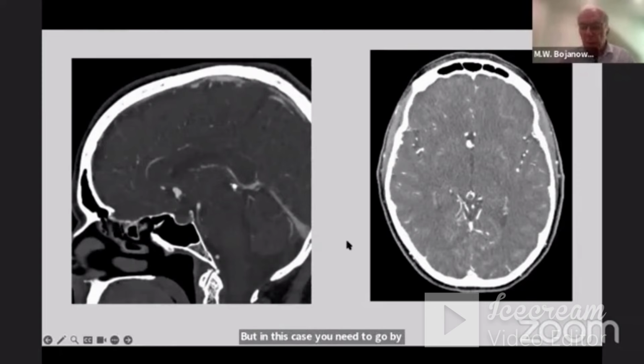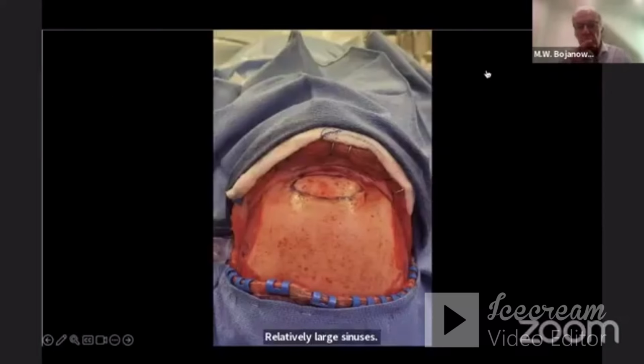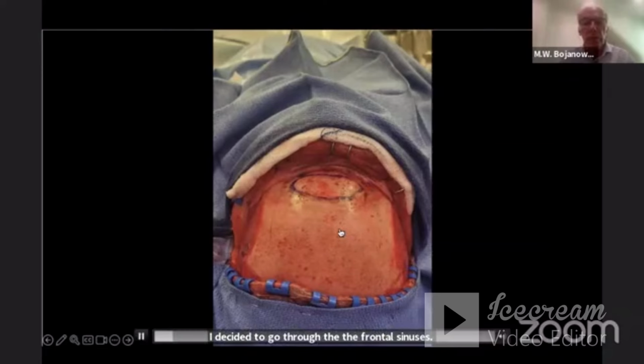And in this case, we had the chance to have relatively large sinuses. So I decided to go through, instead of doing a bifrontal craniotomy, I decided to go through the frontal sinuses. And this is the way. Is the video working?